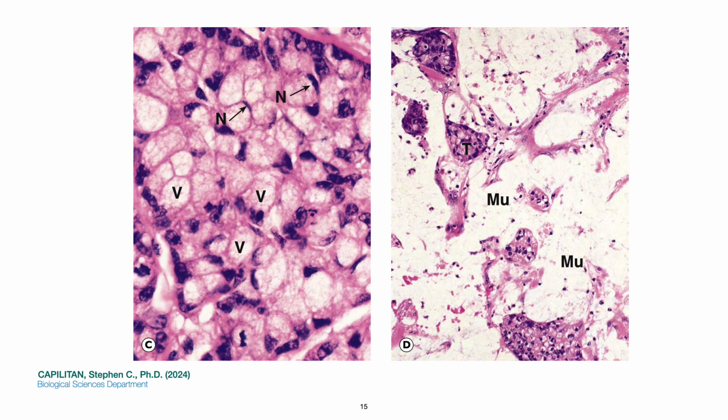In contrast, in a mucinous carcinoma, as shown in D, excessive secretion of mucin, in letter Mu, results in so-called mucin lakes in which small nests of tumor cells are found. This pattern of adenocarcinoma is not uncommon in the colon and is also well recognized in the breast.